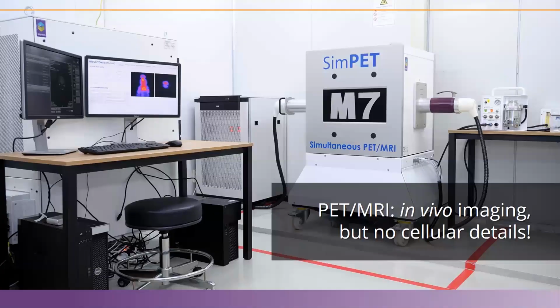So if you want to go for in vivo imaging, you have to go for other options like MRI, PET, or CT scan. These types of imaging techniques give you in vivo imaging. You don't have to kill or sacrifice the animal, and you can image the live animal even for longitudinal studies. But the problem here is you don't get any cellular details.